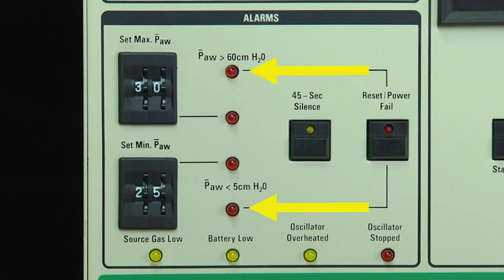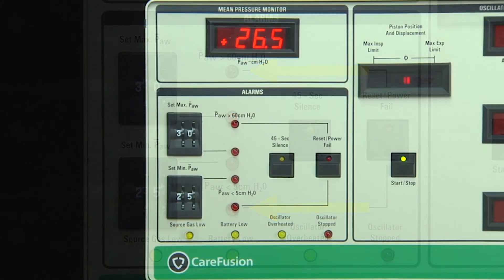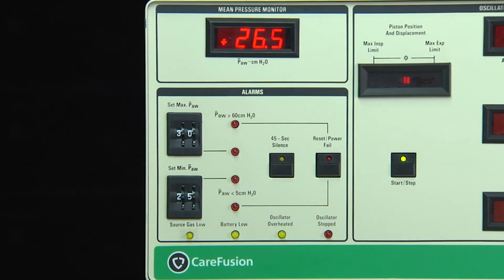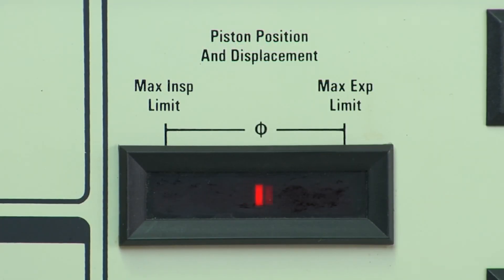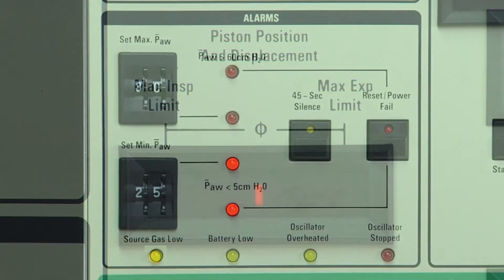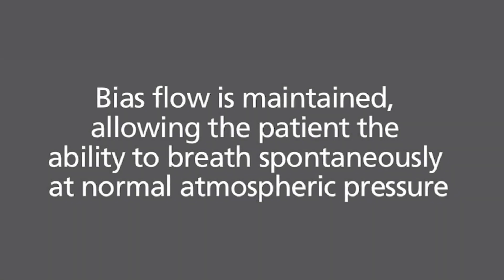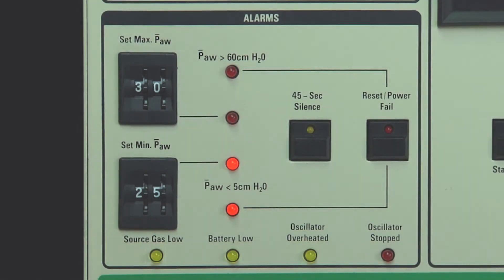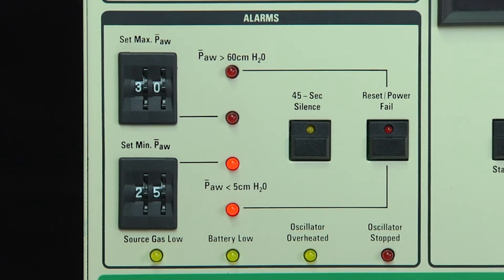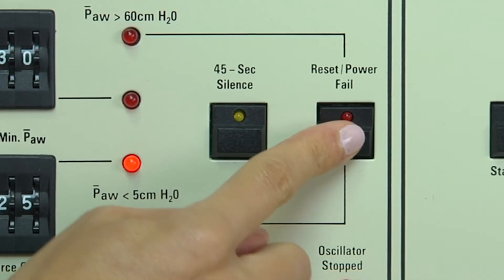Activation of the backup mean airway pressure alarms will also trigger audible and visual alarms. These backup alarms are factory preset for greater than 60 centimeters of water pressure for the high alarm and less than 5 centimeters of water pressure for the low alarm. When these alarms are triggered, the oscillator will stop and the circuit pressures will be vented to ambient pressure. Bias flow is maintained, allowing the patient the ability to breathe spontaneously at normal atmospheric pressure. Once an alarm condition has been resolved, the circuit must be repressurized manually by pressing and holding the reset power fail button.